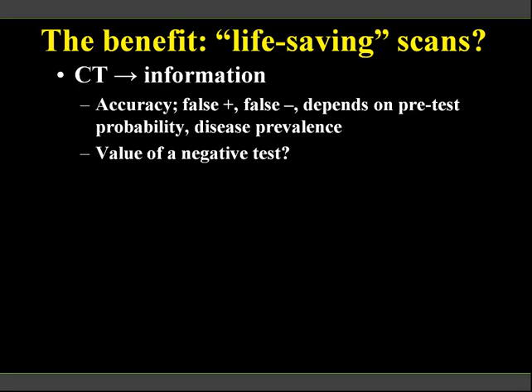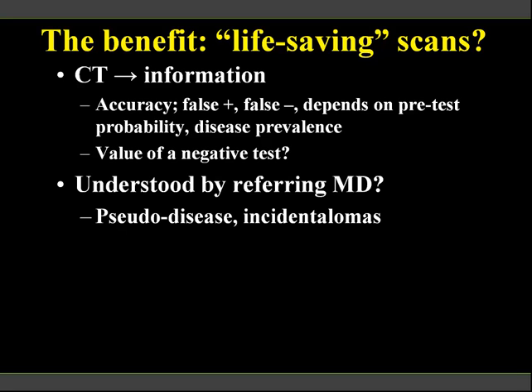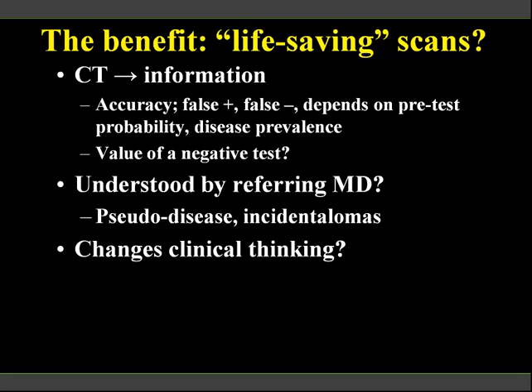What's the value of a negative test? In the United States, it's actually very helpful to do a CT to send the patient out of the emergency room because it's so expensive for patients to be admitted to hospital. So there is a value to a negative test. Is the information that we provide understood by the referring doctors? Is there some pseudo-disease that we identify, or do we identify an incidentaloma that has no implication to the management of this patient, that only leads to further workup?